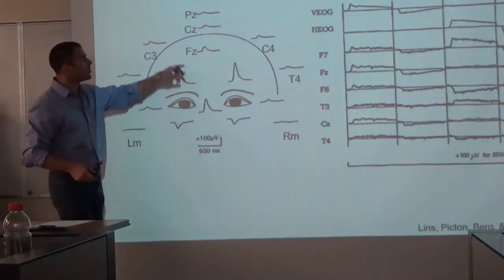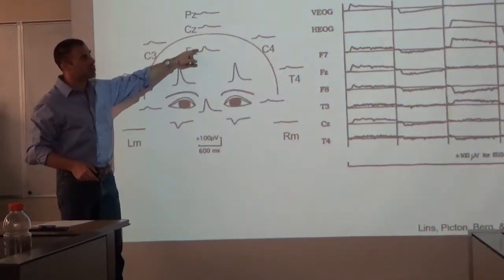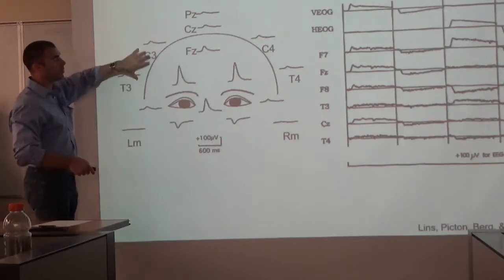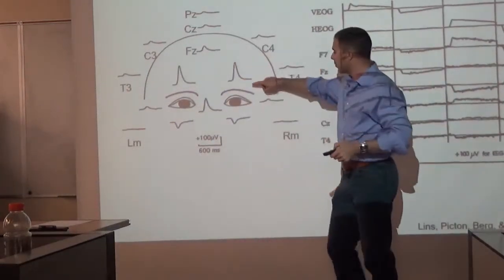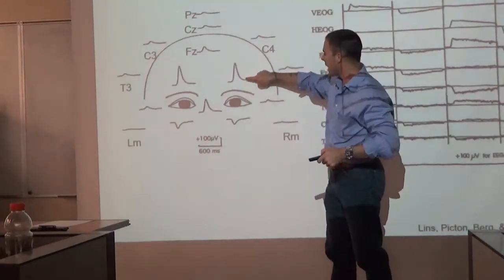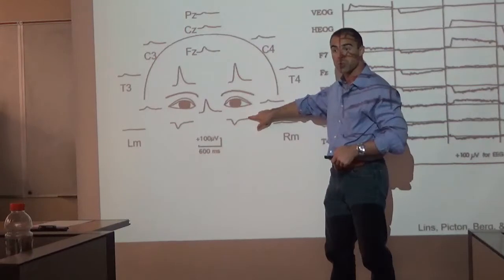You can have all these different patterns of ERPs, or at least of EEG activity, at all of our different electrode sites on the head. In, let's say, a blink, you guys did a really good job of drawing that. You have this big, huge positive deflection, and a corresponding negative deflection as well.